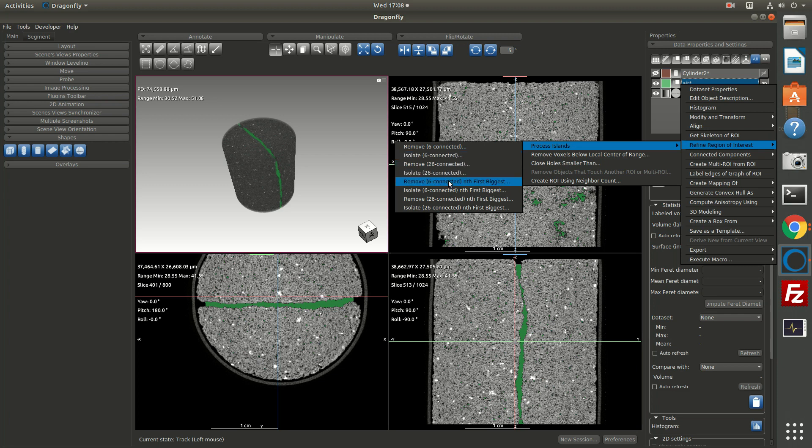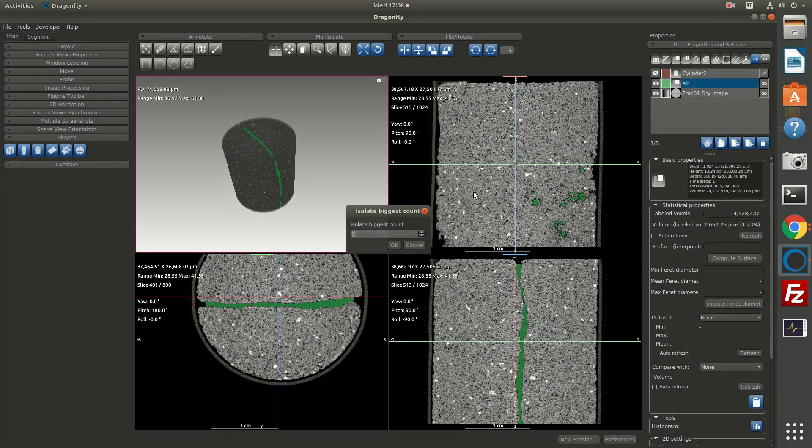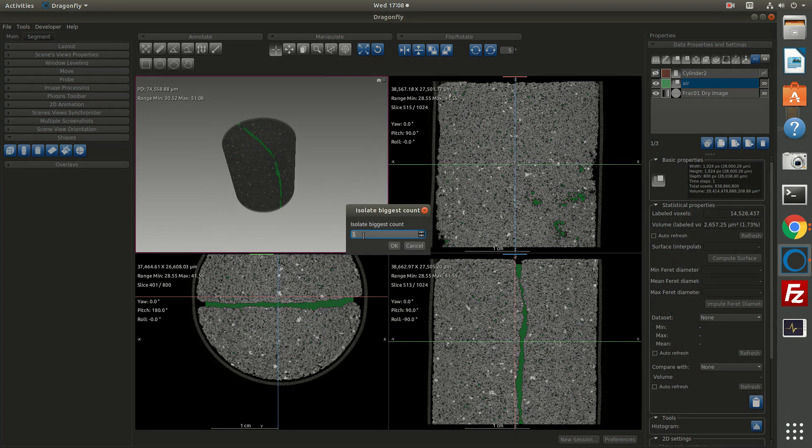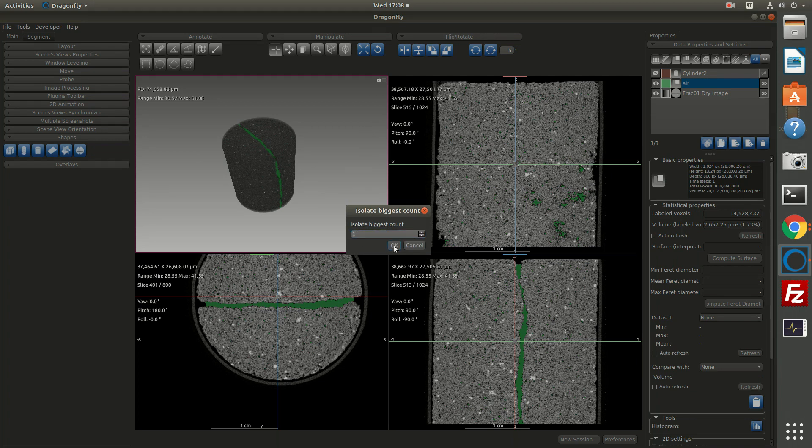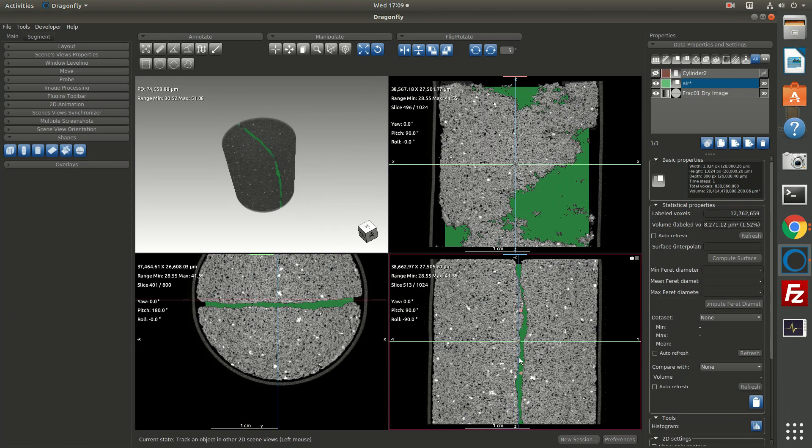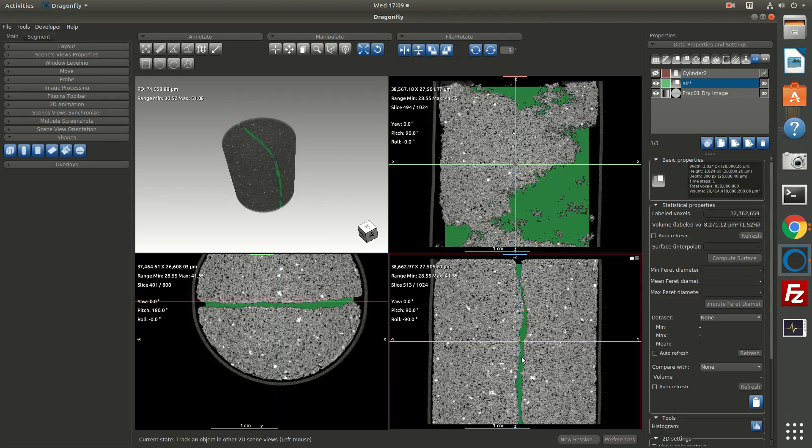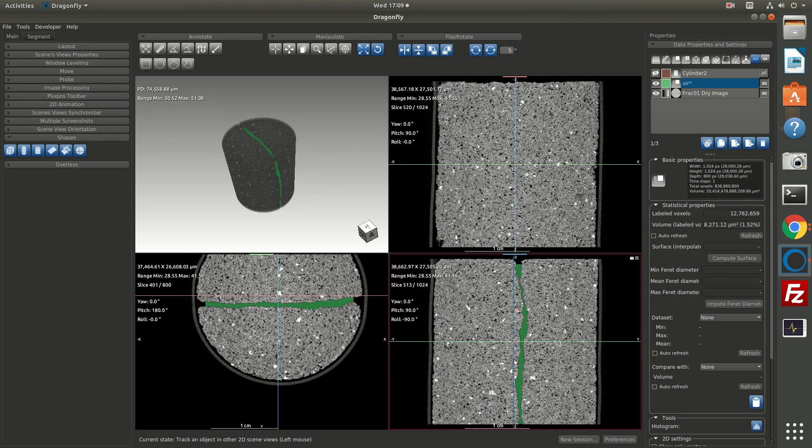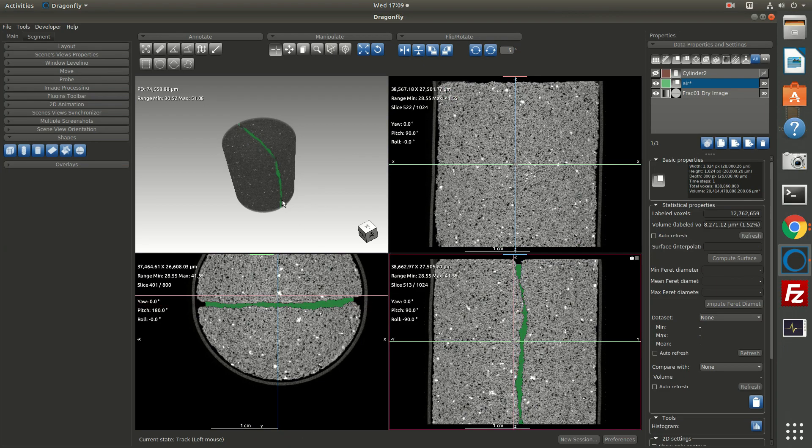If I want to get the largest object, then what I can do is isolate the one biggest object or the two biggest objects. So in this case, I'll just choose isolate in first biggest. And I'll say I just want the biggest object. If there were two fractures in here, I might choose two, but I'll just click one. And now it's removed everything except the largest object, which is the fracture. And so as you scroll through, you can see what the fracture looks like in 3D. So what we've done here is we've created an ROI based on thresholding, and then we masked it with a cylinder, and then we cleaned up with a process islands operation. So we have a pretty good segmentation of the fracture.